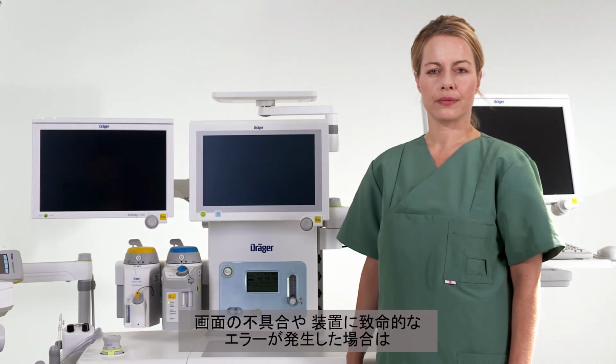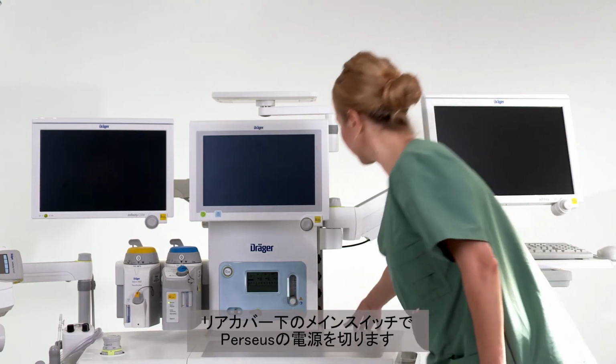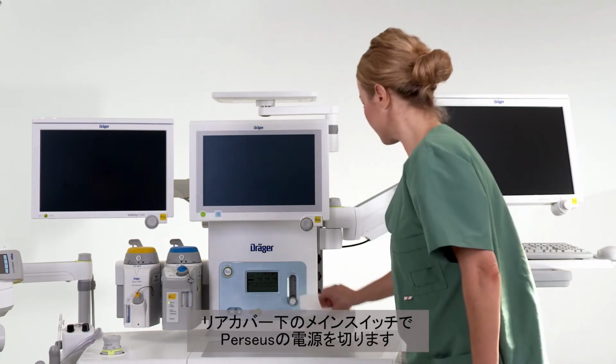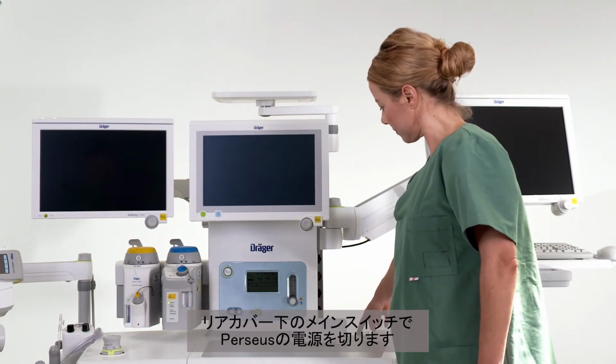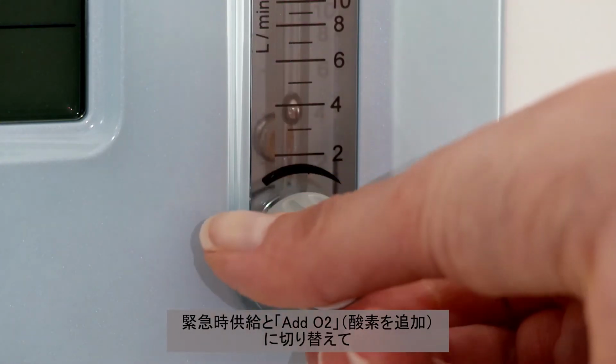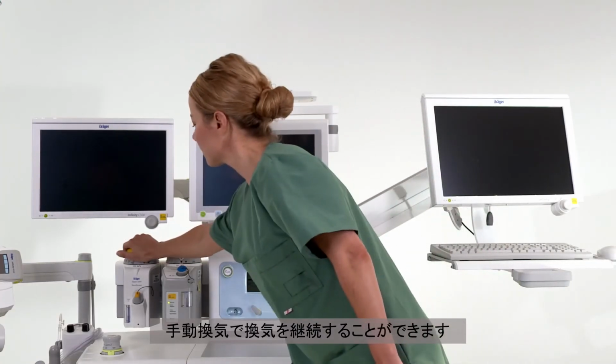In case of a screen failure or a fatal device error, you can turn off the Perseus using the main switch underneath the rear cover. You can switch to emergency delivery and the Add O2 mode to continue operation in manual ventilation mode.